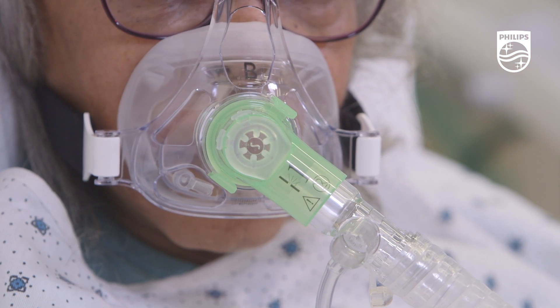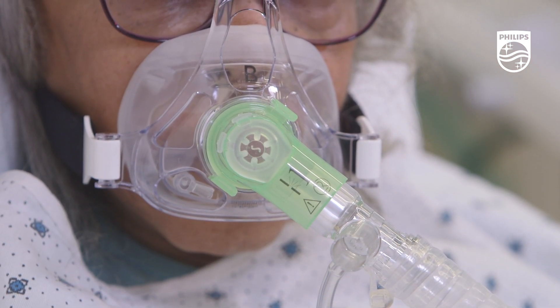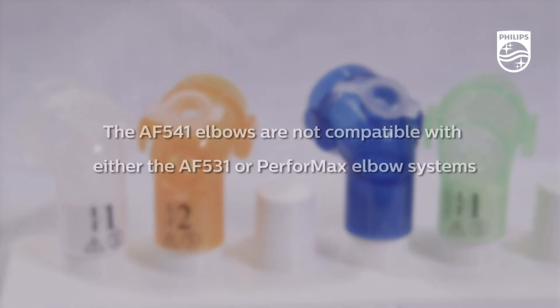A green bronchoscopy elbow is also available, but you should note that the AF541 elbows are not compatible with either the AF531 or Performax elbow systems.